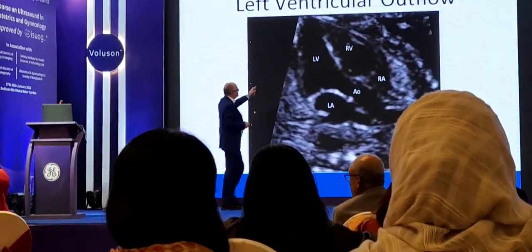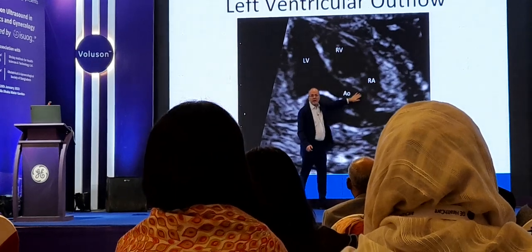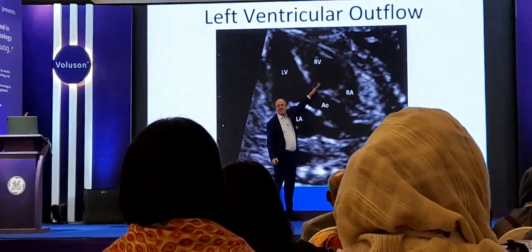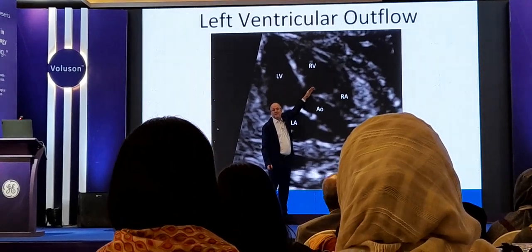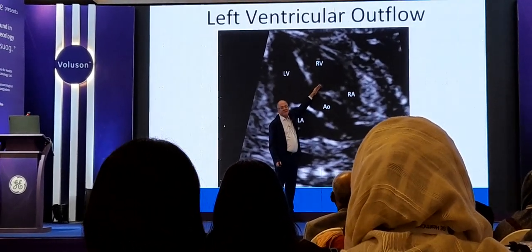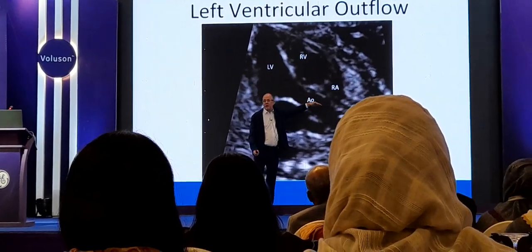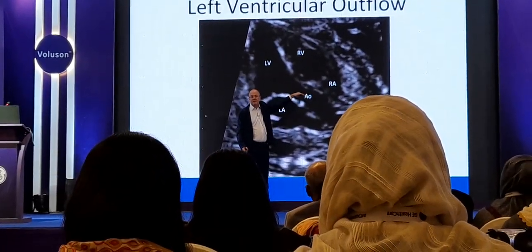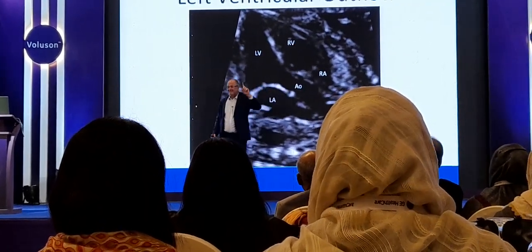Can you see this continuity? This line is continuous. Beautiful line. There's a break there. What is that? The VSD. Does anybody remember VSD? So continuity and a beautiful curve. Can you see that curve? It's an angle, it's not straight. You're going to see a case where it's straight. Remember that.